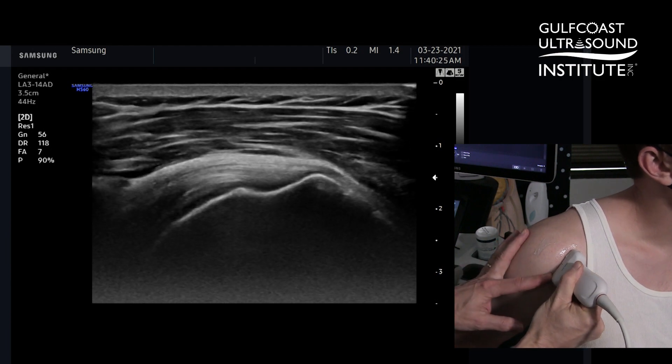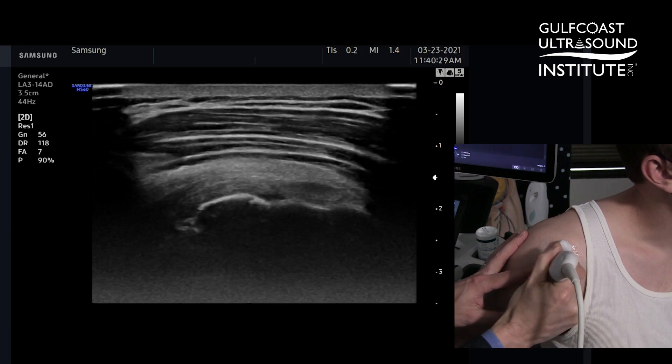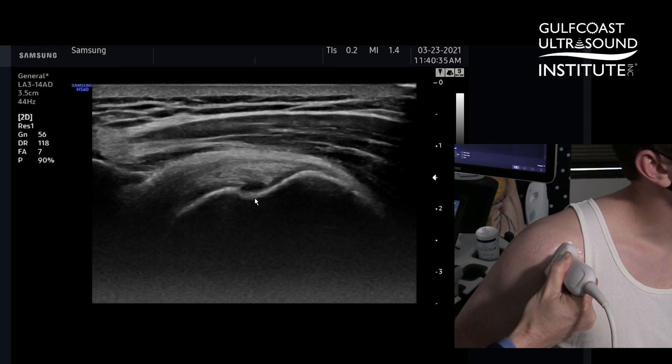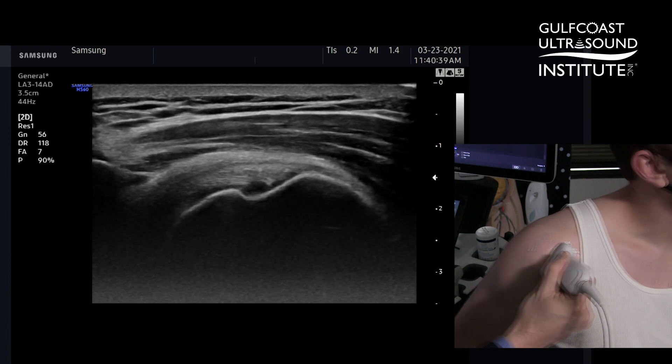That will define the plane as I move more posterior toward the infraspinatus. Now anteriorly, when we have a well-defined angle between the greater tuberosity and the humeral head, this is the superior facet, therefore I know that this is the supraspinatus.